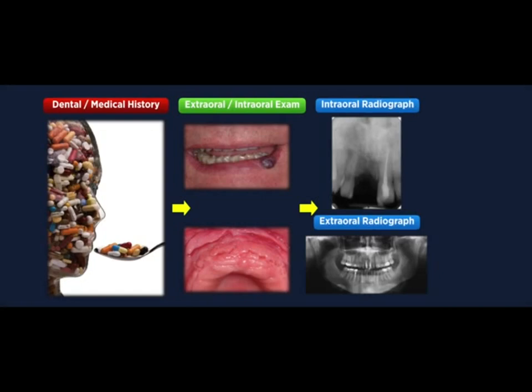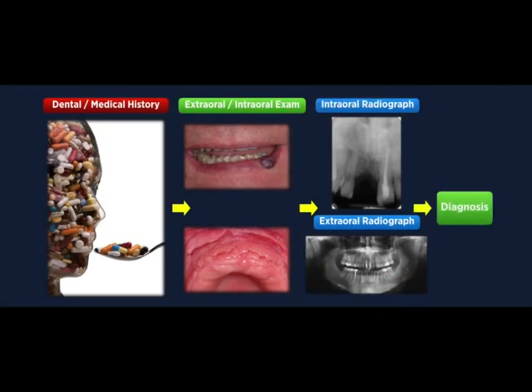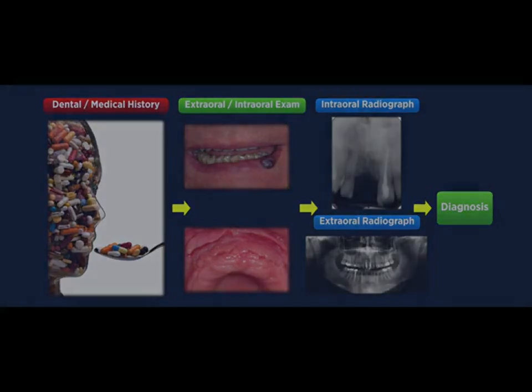Those together, dental history taking, extraoral exam, and the radiographs we take for these patients, they form the basis for a diagnosis. And the diagnosis is central to decide upon a therapy. So you see that for the whole diagnostic process, radiographs and thus all radiology are an integral part of this process. Let's go back to some definitions.